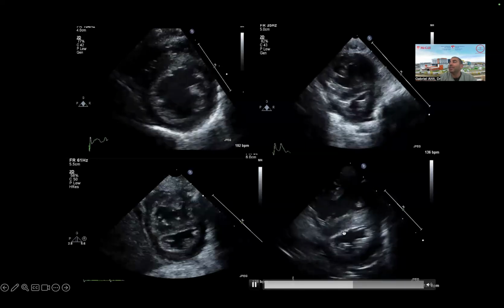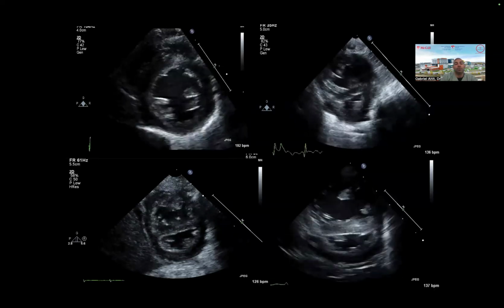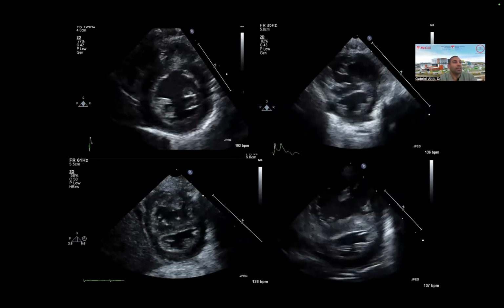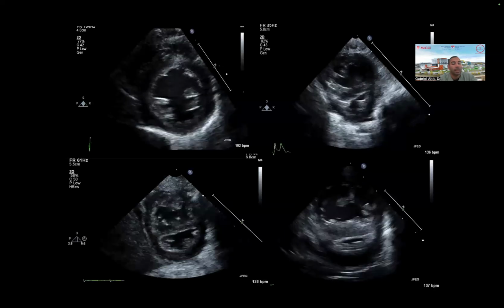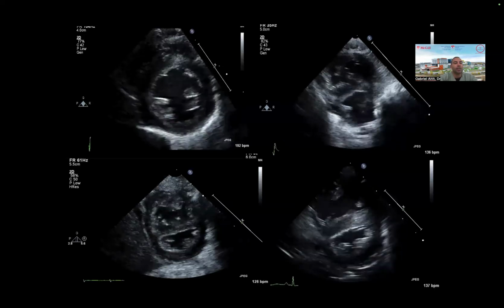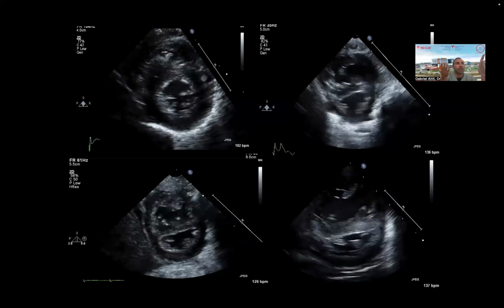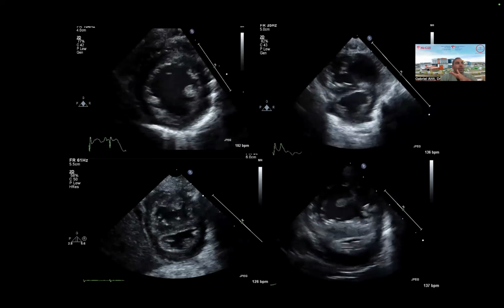So this patient, for example, could be a patient presenting at 6 months old with a TGA that was never diagnosed, right? Because his RV is systemic and now the LV is completely pancake. It's not. This is a kid who had severe pulmonary hypertension. But just to put you in line, sometimes it's because the RV is systemic and the LV is subpulmonary.